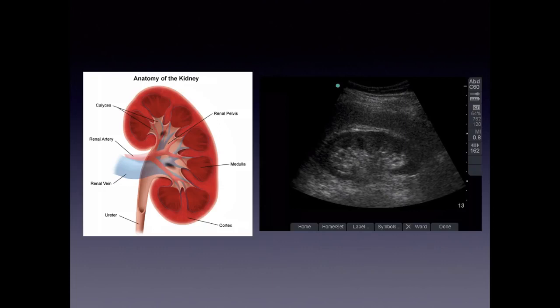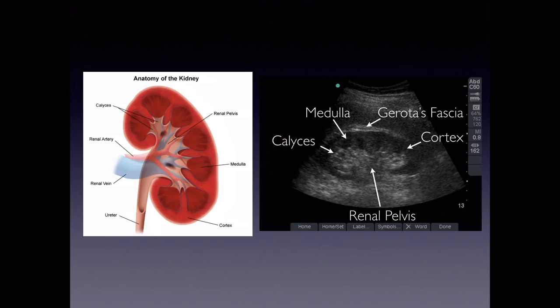The exterior part has Gerota's fascia and perinephric fat, which is hyperechoic. The renal pelvis is also hyperechoic, and the renal sinus is where you would see dilation if there was hydronephrosis — it would appear anechoic within that hyperechoic area. The medulla is more hypoechoic to the cortex, and the calyces drain into the renal pelvis.